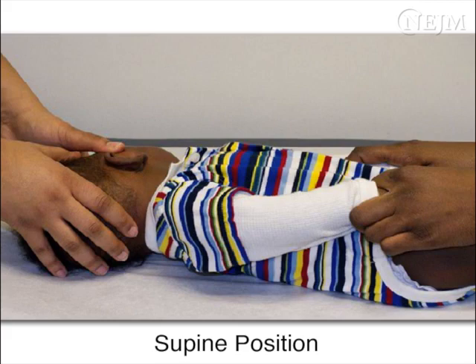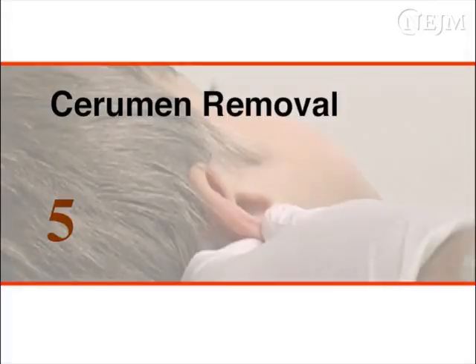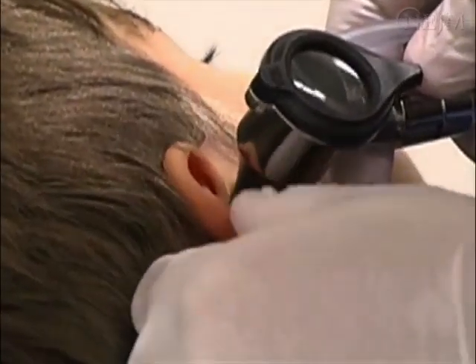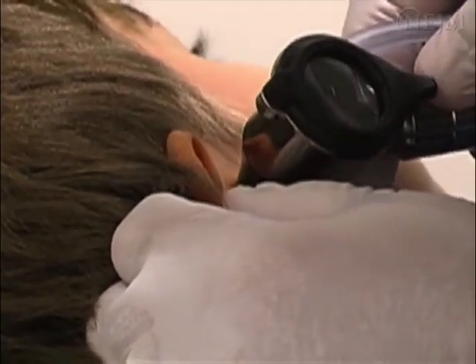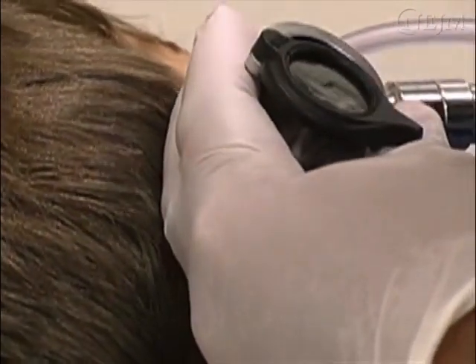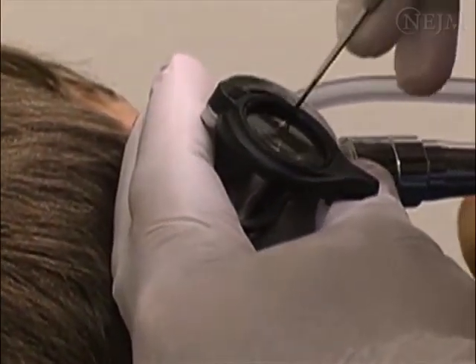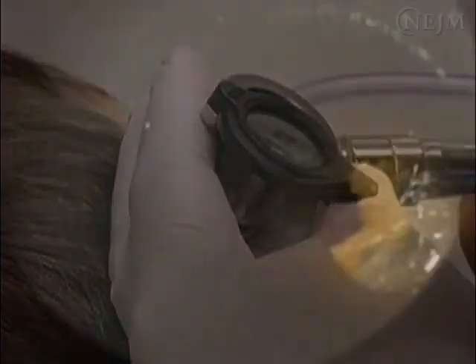Depending on the child's position, one of the assistants must also firmly hold the child's hands. With the child fully immobilized and with the child's head secured by an assistant, insert the otoscope into the external auditory canal using your dominant hand. Once in the proper position, use your non-dominant hand to hold the otoscope in place. Partially displace the lens of the otoscope and insert the blunt ear curette into the speculum.